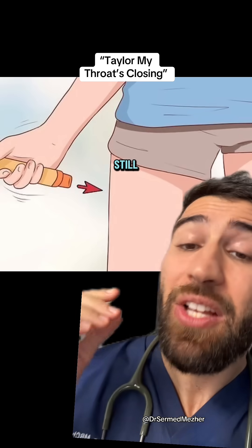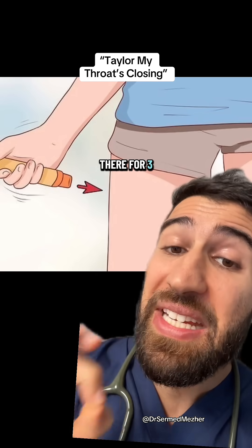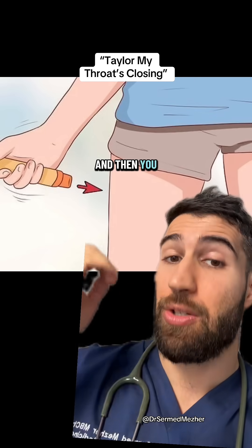The receiver then holds the leg still and you push the pen against their upper outer thigh and hold it there for three seconds to allow all the medication to discharge, and then you can remove it.